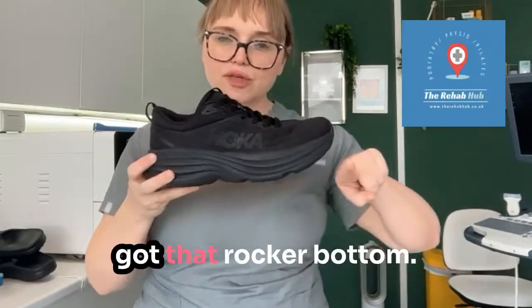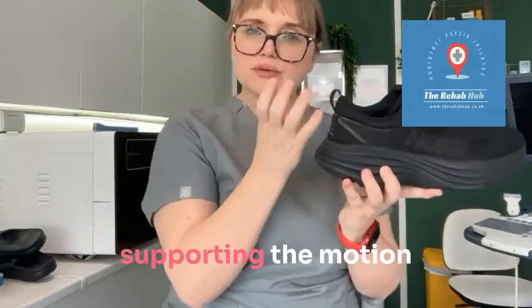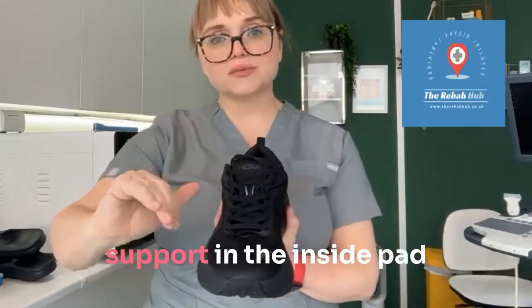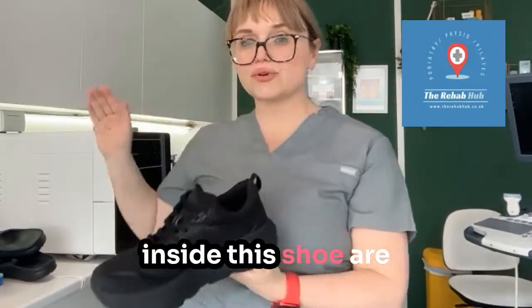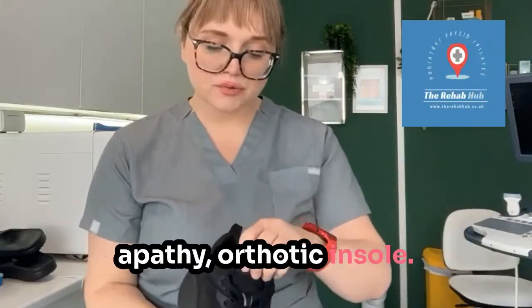Doesn't bend, and it's got that rocker bottom, and it doesn't twist. It's got calcaneal support, so it's supporting the motion and the movement at the back of your heel. It's got a medial arch support. It's got this arch support in the inside part of your foot. I'll show you what that looks like in an insole, because a lot of the time, prescriptions inside this shoe are very similar to what we would give for a plantar fasciopathy orthotic insole.